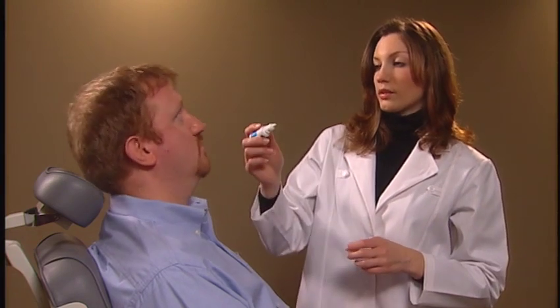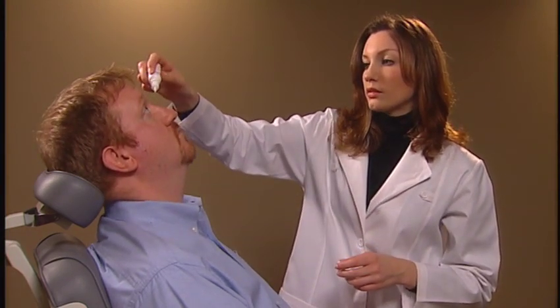The first step is to anesthetize the patient's cornea by the application of a topical anesthetic.